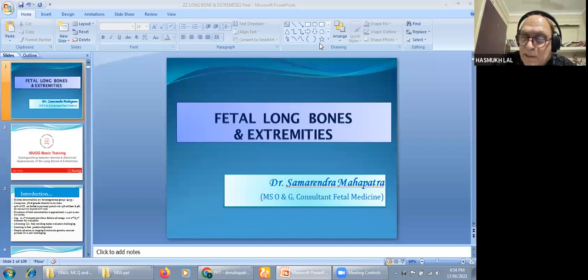Last time, Madhumita Mahanti very clearly told us that whenever there is enough liquor, first we look at the liquor, then the bladder, and then the kidney. If there is adequate liquor, a normal fetus will always be moving a lot.